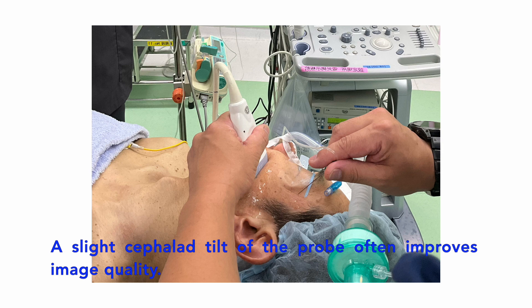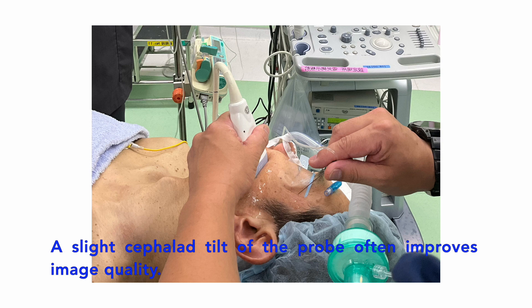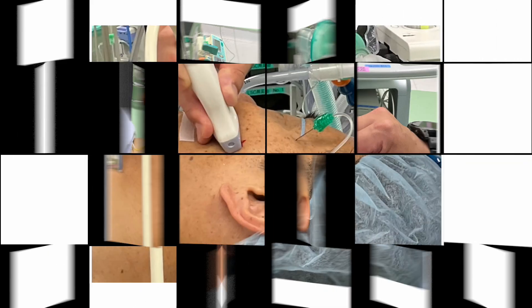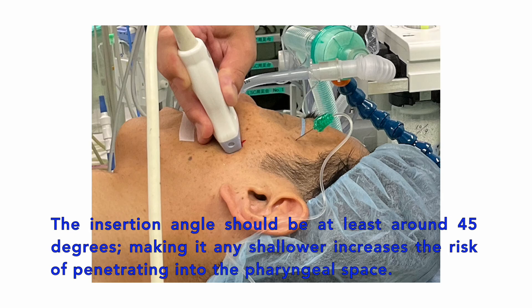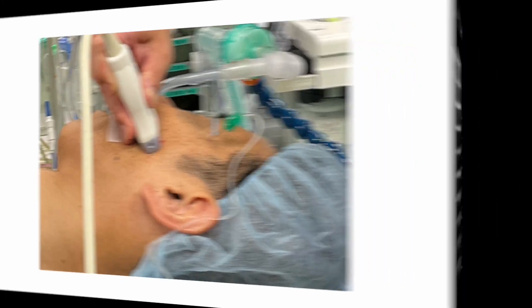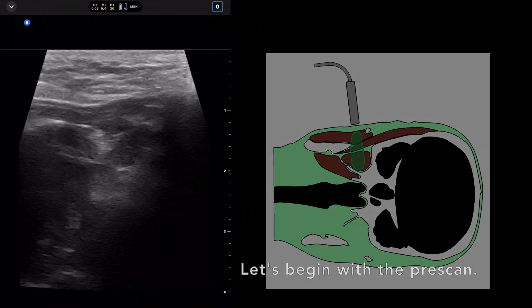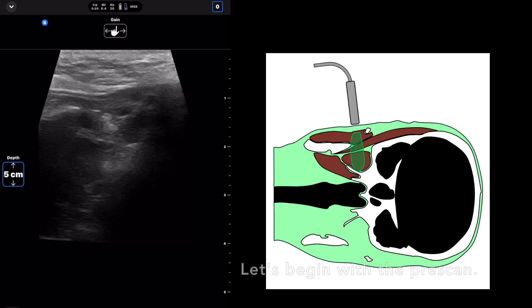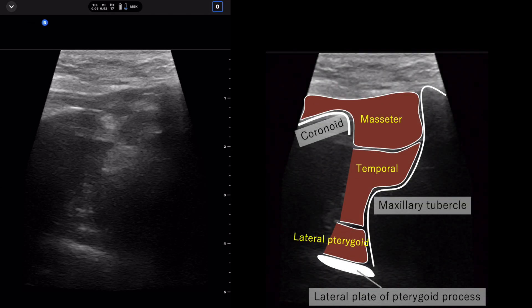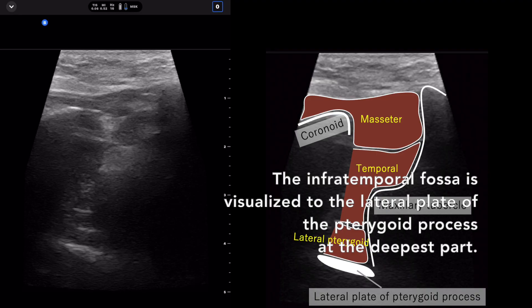A slight cephalad tilt of the probe often improves image quality. The insertion angle should be at least around 45 degrees — making it any shallower increases the risk of penetrating into the pharyngeal space. Now let's begin with the pre-scan. Set the depth to five centimeters.